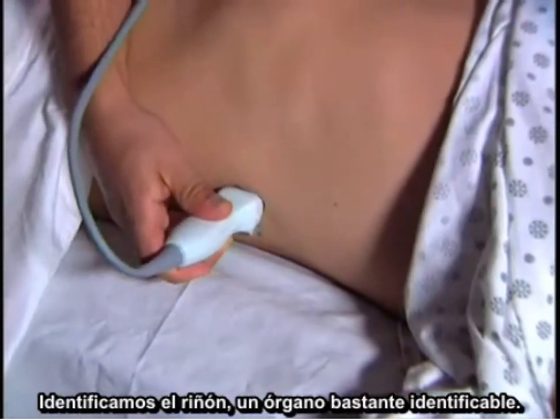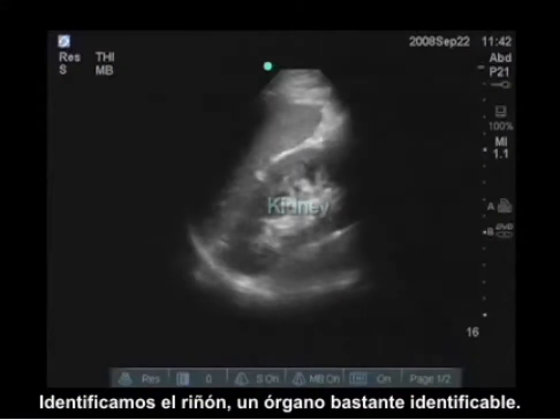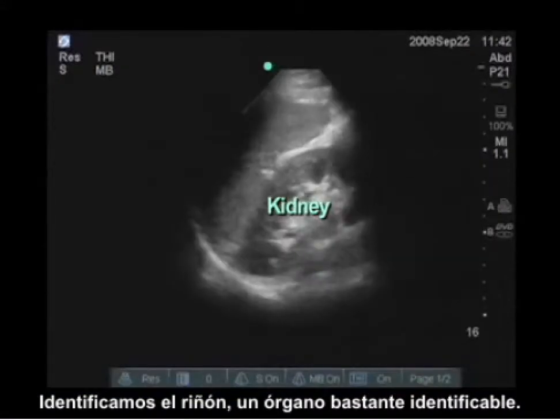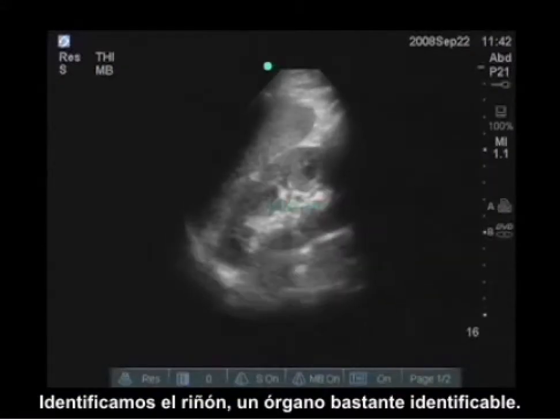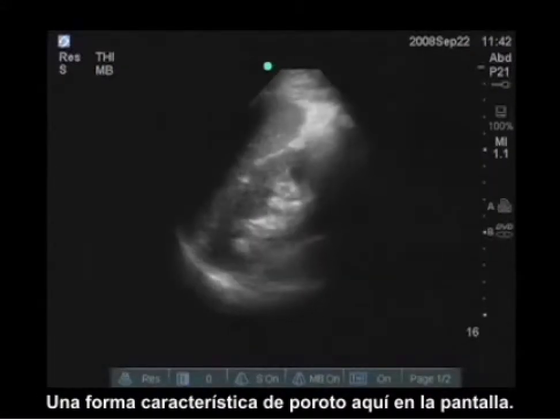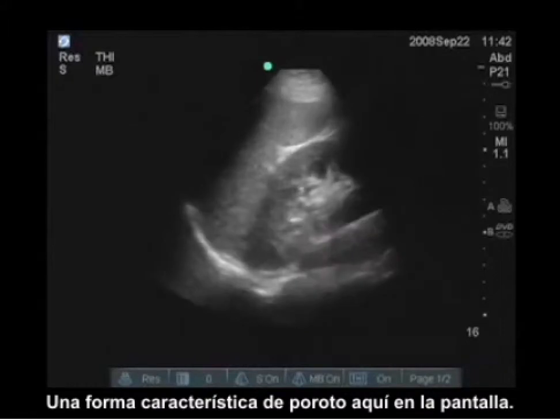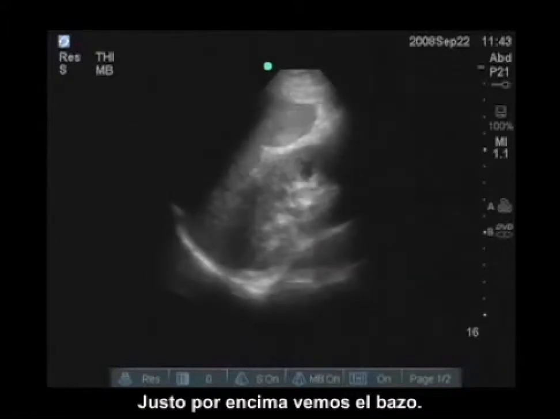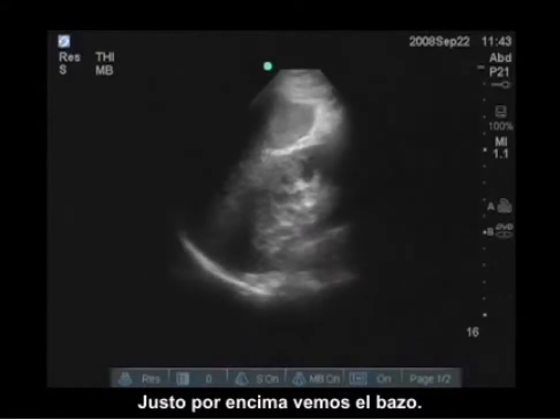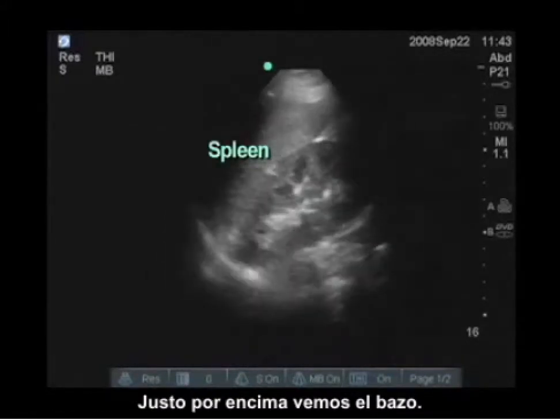You can identify the kidney — that's going to be a pretty identifiable organ with its characteristic bean shape, and we can see it here on the screen. Just above it we're going to see the spleen.